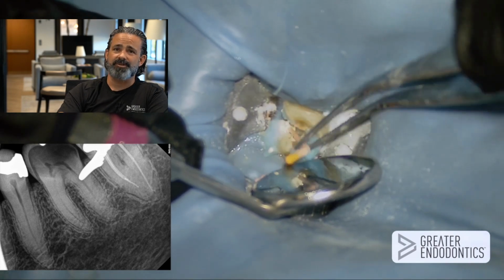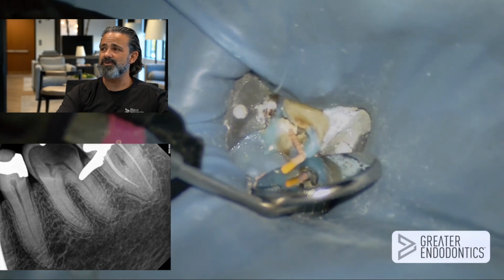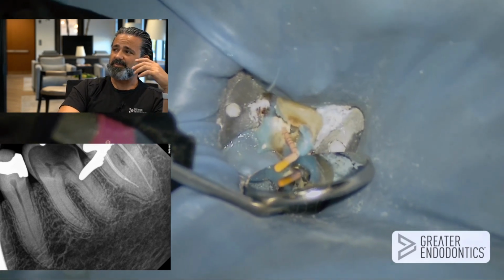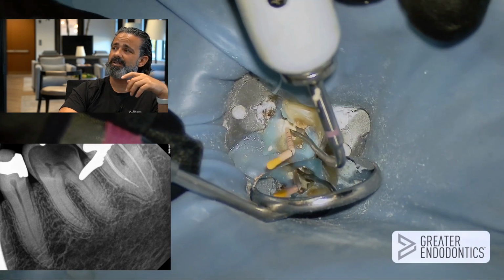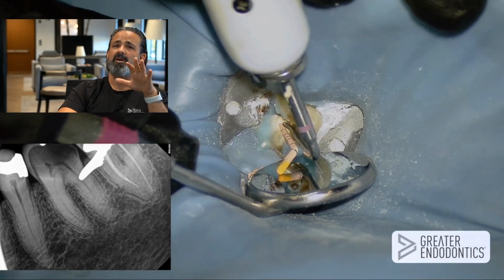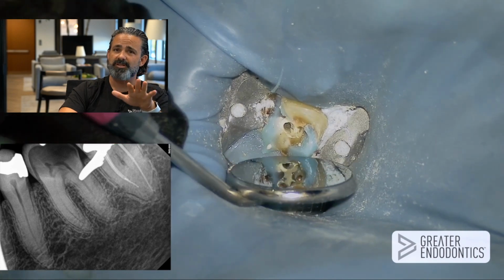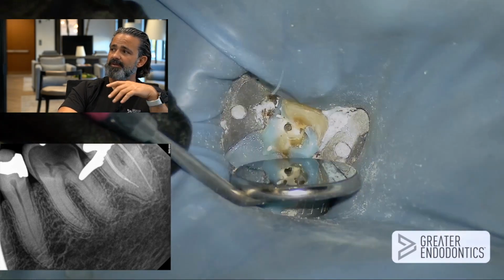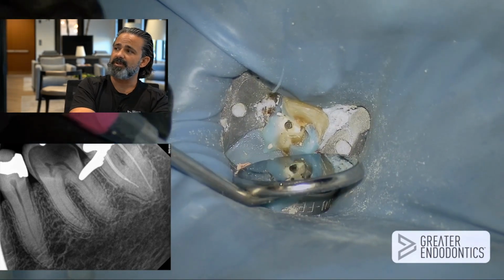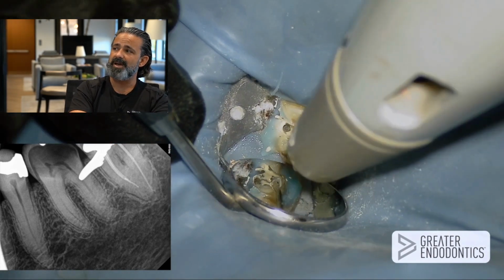So just traditional obturation technique. It's a modified continuous wave. I mean, really what I'm doing is I'm just taking my heated element, my hot stick, whatever you want to call it, just into the canal and giving me the ability to push a little bit of apical pressure, followed by a plugger. This is a Buchanan plugger, Buck Pull-Up plugger. And then I'm just going to backfill the top.